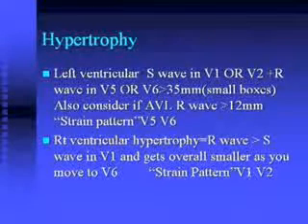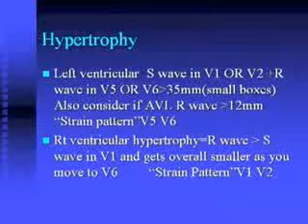The next section is on hypertrophy criteria for the 4 chambers of the heart. Dean, this looks pretty busy. Any helpful hints on these criteria? It is busy, and although it will require using the guidelines, often the students will carry it in their pocket for the 3rd and maybe even some of the 4th year, it does finally become fairly easy to follow and can be done fairly quickly.